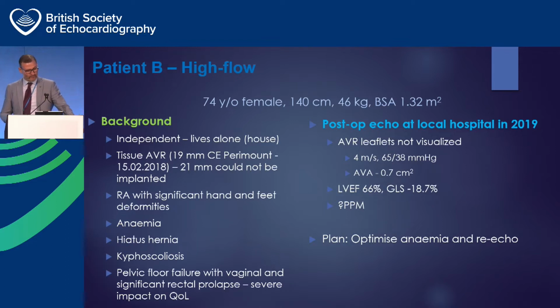So moving now to the second patient. This is a complex patient, and I don't think it's a clear-cut answer at the end. The patient's a 74-year-old female. She's short in stature, so 1.4 meters tall, 46 kilos with a body surface area of 1.3 meters squared. She lives alone, she's independent, she lives in a house, so she can climb stairs.